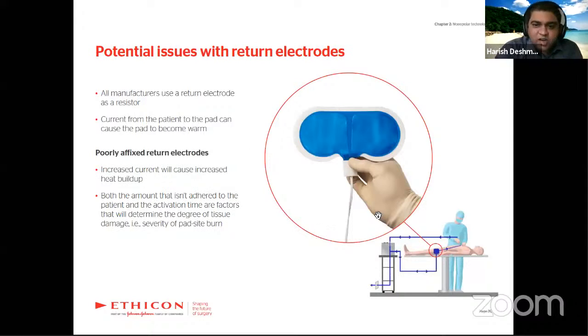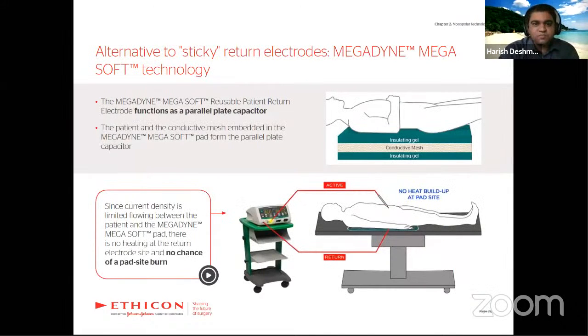All electrode pads have the same thing. The only issue is with the sticky pads, because they have a gum which generally wears off after certain use. So it is advised not to use it a second time.